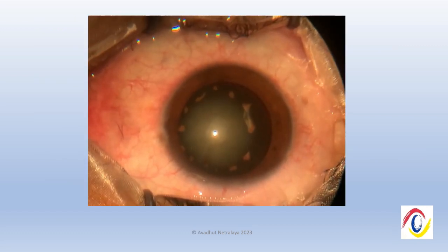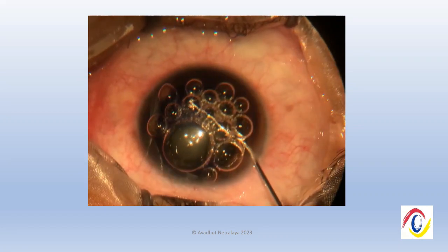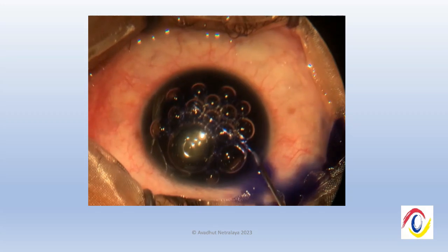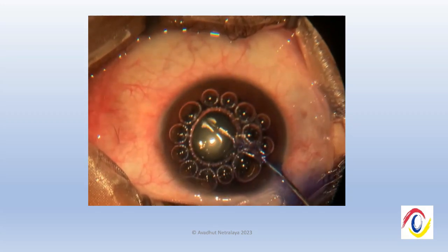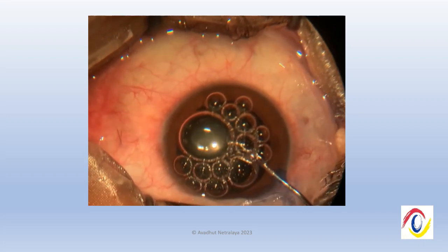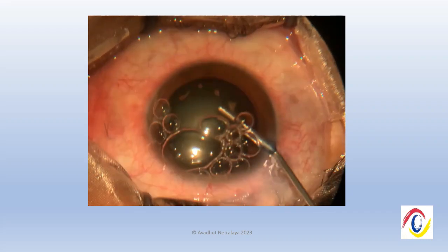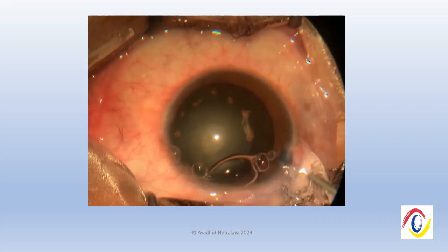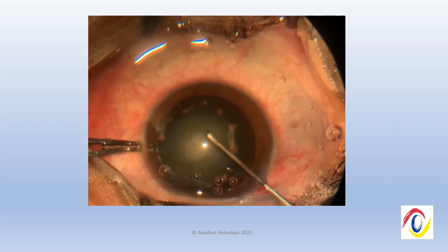This is the video of the cataract surgery for the patient. We performed staining of the anterior lens capsule using trypan blue. We found that the stain did not take very well on the anterior lens capsule, which otherwise it would for a case of a mature cataract.